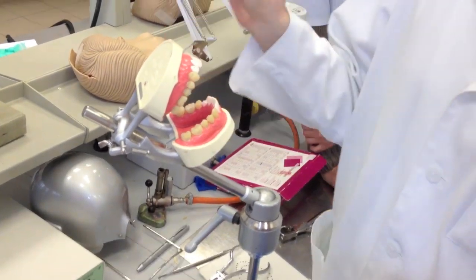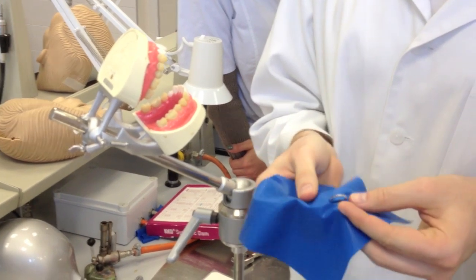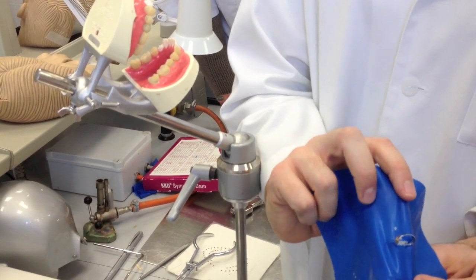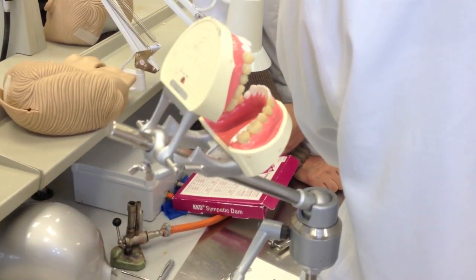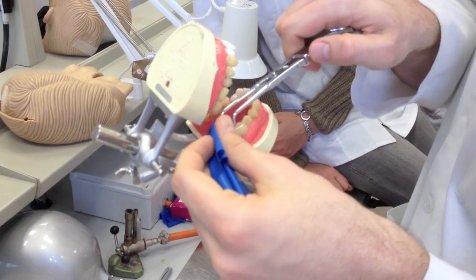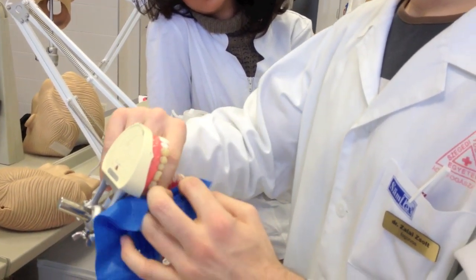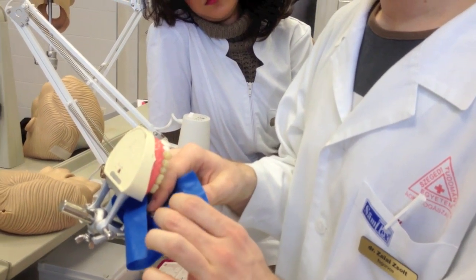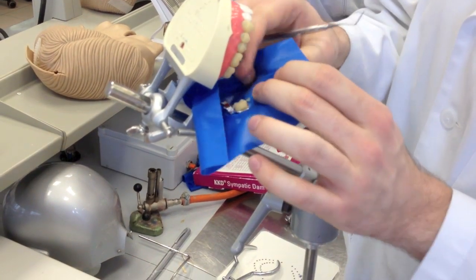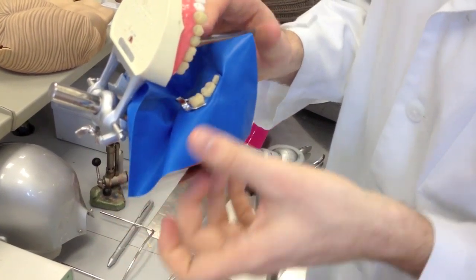What if we want to do the same thing with a wingless clamp? We can do it because then we will use the connection area — this bracket part — for the fixation. Use the forceps. In the mouth it's a bit more difficult. Place it on the tooth, check if it fits, then the same way pull it through. It's a bit easier because you don't have the wings which can disturb placement.